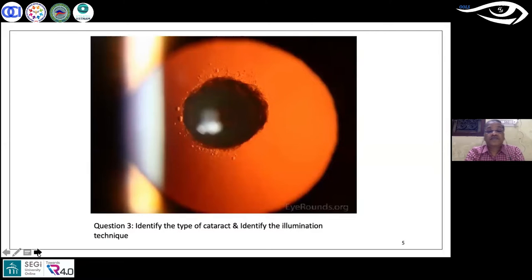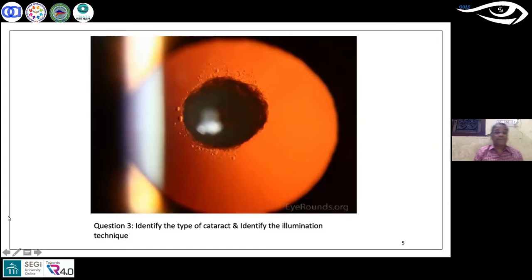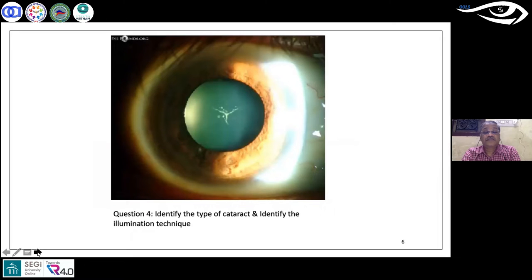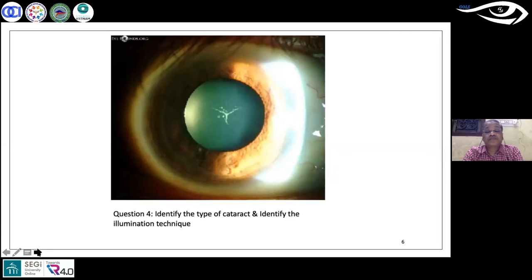Moving to question three: looking at the image on the zoom screen, what type of cataract is it and which illumination technique has been used? There is a clear winner — the majority voted for PPC and retro illumination. For the fourth question, identify the cataract type and the slit lamp illumination technique used. Majority — 64 percent — think it's Y-sutural cataract with diffuse illumination.